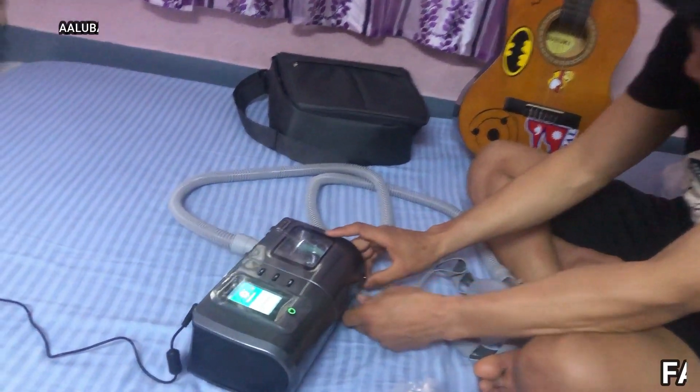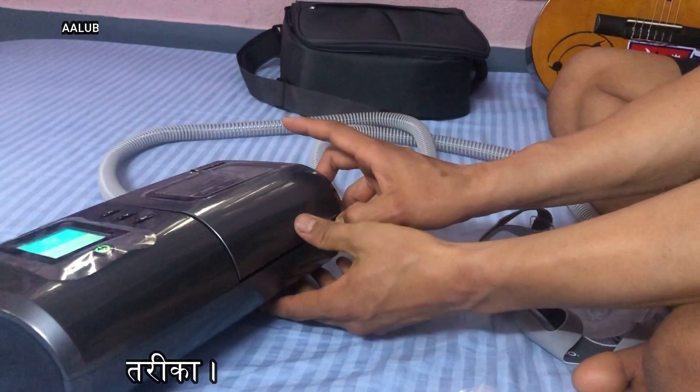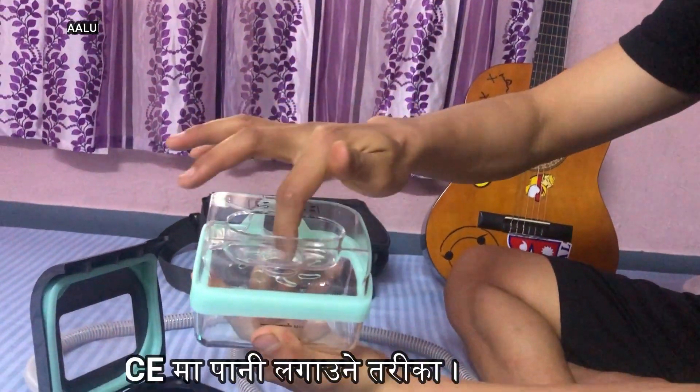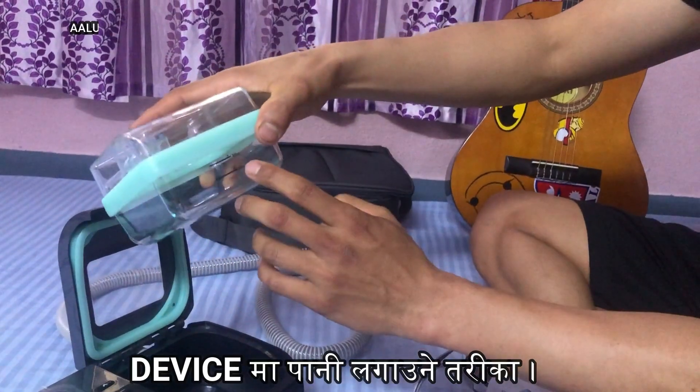You can see the water chamber on the bottom. You can open it and store the water inside.